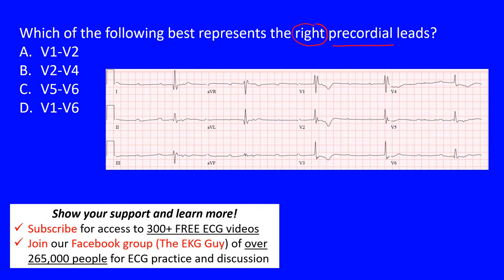Here we have a standard 12-lead ECG minus the rhythm strip, which you often see at the bottom. On the left side we have our limb leads, and on the right side we have our precordial leads. So we already know the answer will be on the right side — but since choices A through D are all on the right side, we need to narrow it down further.